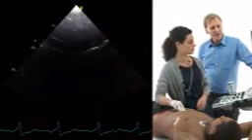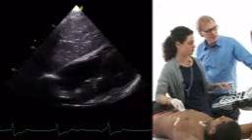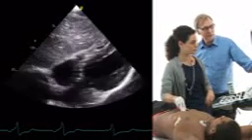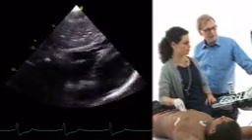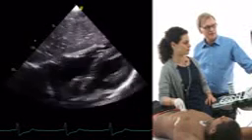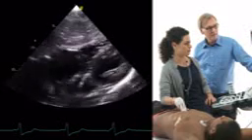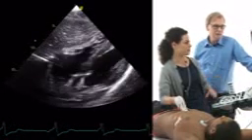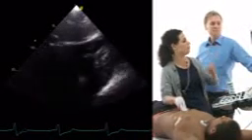Now we'll again just focus on the right ventricle. And the nice thing is that the right ventricle is good to visualize, and you can assess not only the thickness of the wall, probably better than in any other view, but you can see the size very nicely. Yeah. And obviously also the function. You see it's relatively close to the transducer, right under, or let's say above the liver. And this, I think, is a good view. I think you can really compare the right ventricle with the left ventricle and see how big it is in comparison.